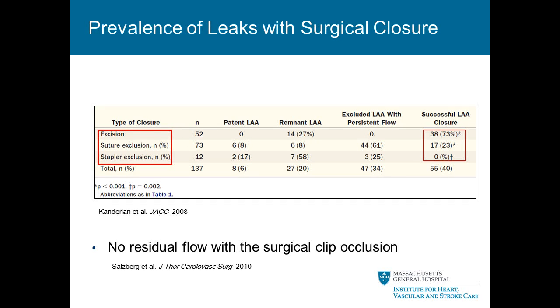In this study from the Cleveland Clinic, looking at the residual flow with the surgical clip, which is a new device for closure, there were no leaks. They had complete closures in all patients.